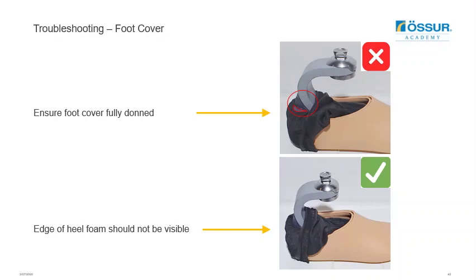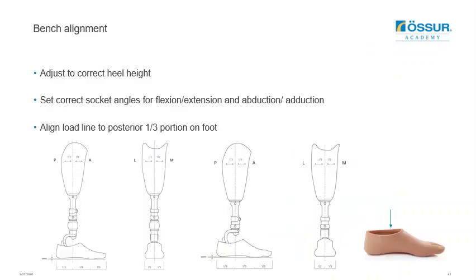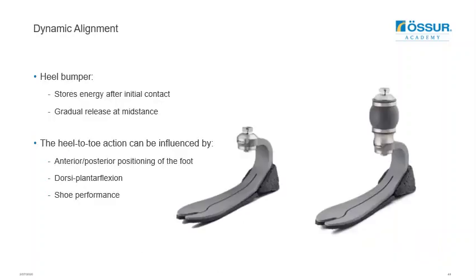Once the heel clip is confirmed in position, pull the Spectra sock back up around the C-shaped portion of the foot. The bench alignment for both feet is the same as the rest of the foot range — account for the heel height of the shoe and align the reference line through the posterior third of the foot, using the alignment reference line on the inside of the foot cover. For dynamic alignment, keep in mind that the heel stores energy after initial contact and releases it to guide the patient into mid stance. Consider anterior and posterior shifts to the foot, as well as plantar flexion and dorsiflexion, as these will affect the rollover and may need adjustment per user.